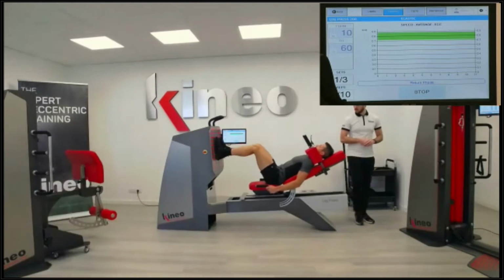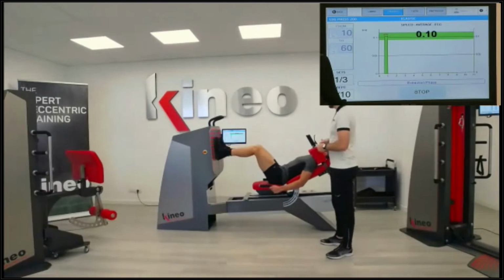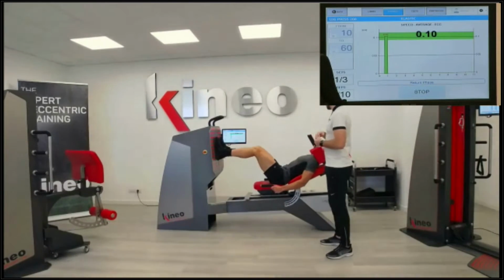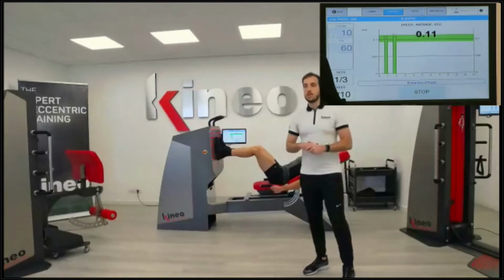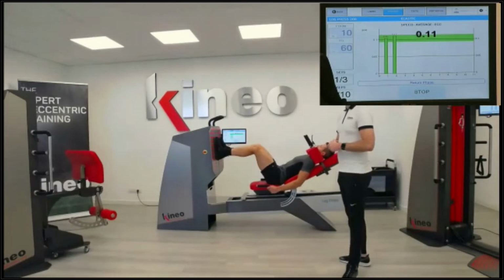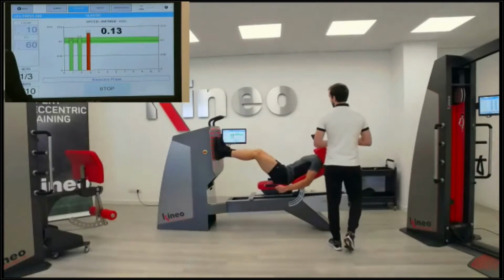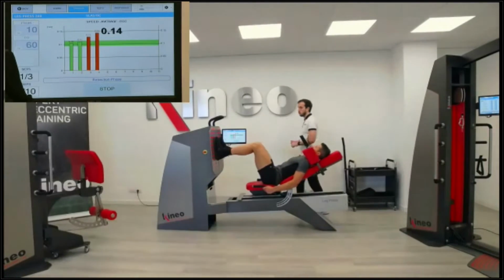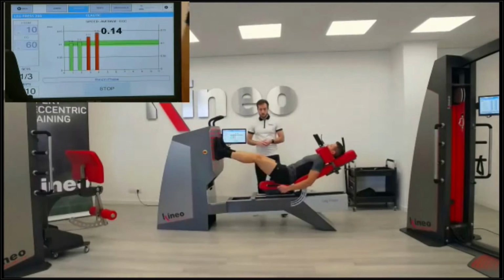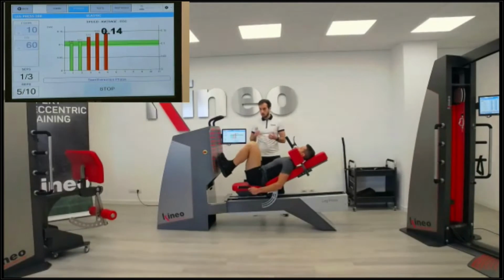All right. Do not hyperextend. Perfect. Good. As well here, of course, right now it's just for camera purpose. Damiano cannot see the screen because it's tilted. But of course, here we have the same biofeedback for Damiano to follow his execution. Now everything is perfect. And all right, good.